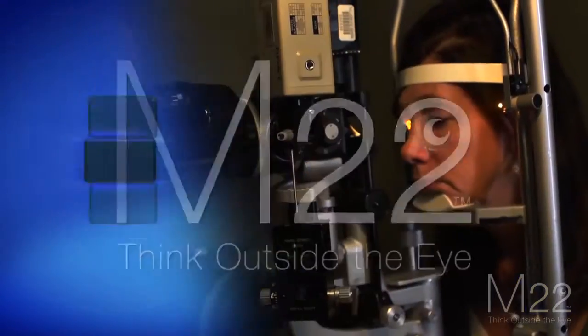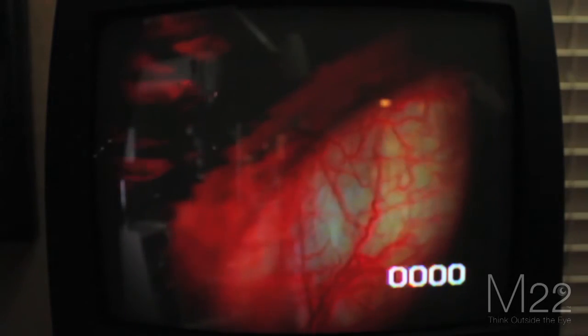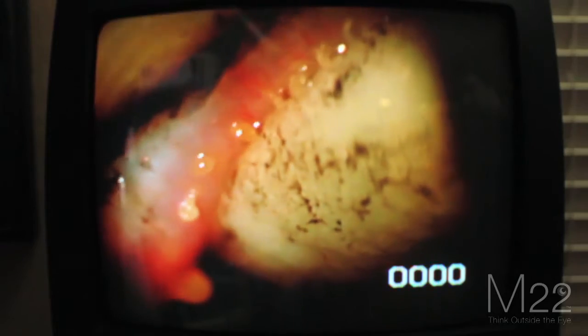We've just finished the IPL and brought the patient over to the slit lamp. We now have the ability to work on these blocked glands. I take a moistened Q-tip — there are about 30 to 35 meibomian glands in each of the lids. These glands are supposed to secrete an olive-oil-like secretion, but she's making a toothpaste-like secretion. You can see the energy goes up to the upper lid and actually opens it so that you can do gland expression.